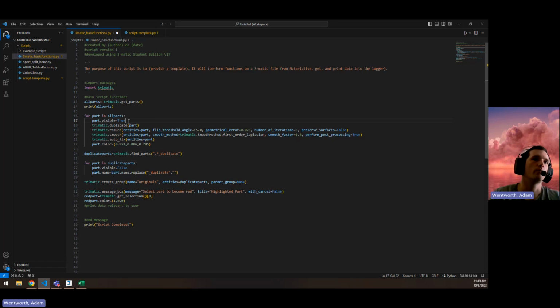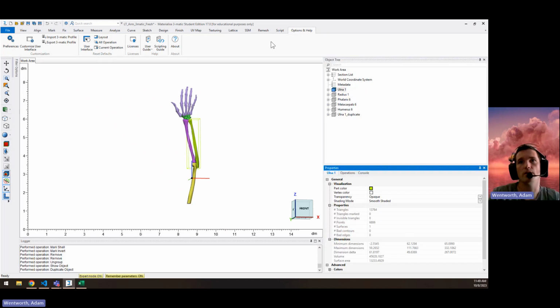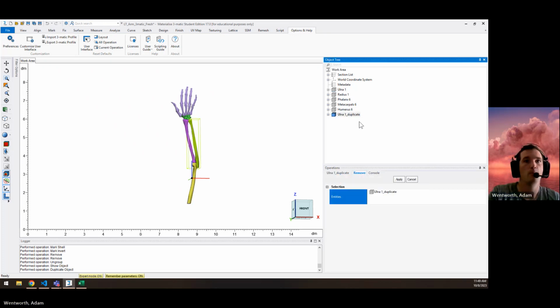So here we're making a part visible. We're duplicating the original part. What that does is create the same part at the bottom of the object tree. It's not in any list yet, and it's not assigned to any variables yet. It creates the same part, but the name is underscore duplicate. So I'll do that manually with, say, the ulna here. If I hit Control D, which is the shortcut to do that, you'll see what it does. Creates a new part, underscore duplicate. Great.